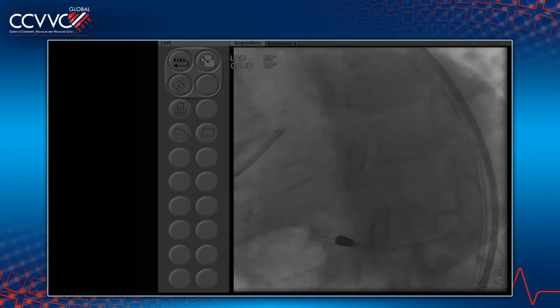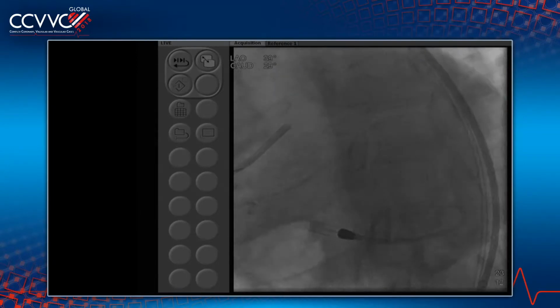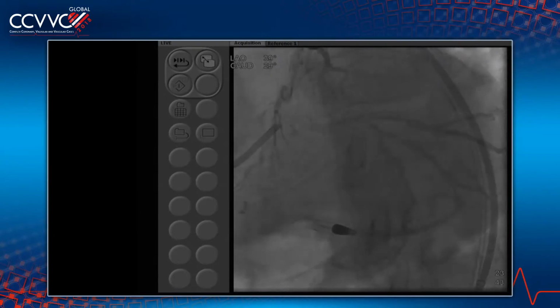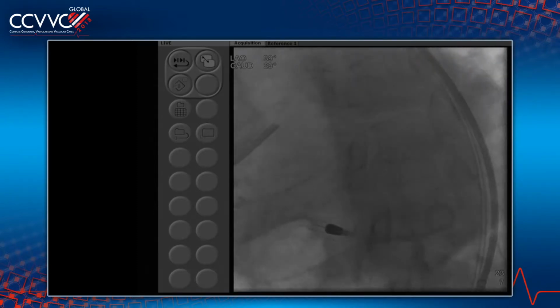I know it's a small side branch, but nowadays with the Impella support, you really can afford to do something more. It's not critical, but I think also in preparation for your future plan, I know, Anu, that you're bringing this patient back for the right coronary at some point, it's not a bad idea to make sure that your highways to the right coronary, the retrograde highways, are well taken care of.